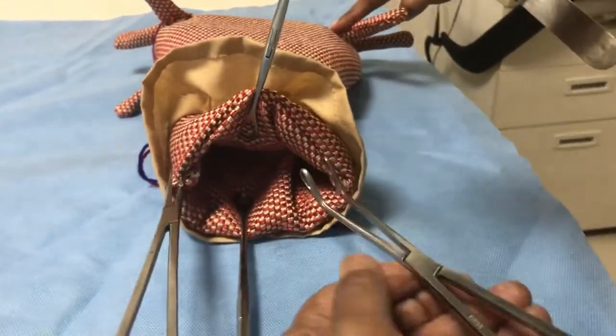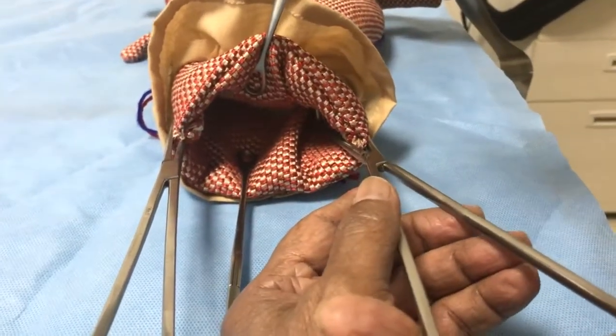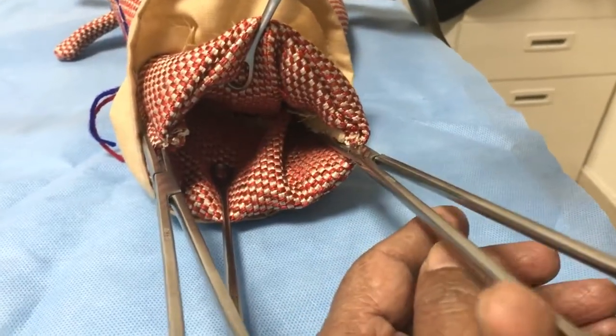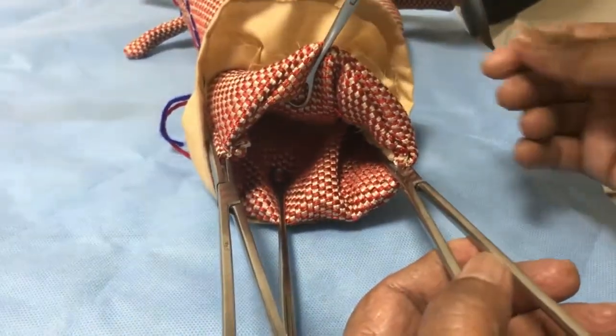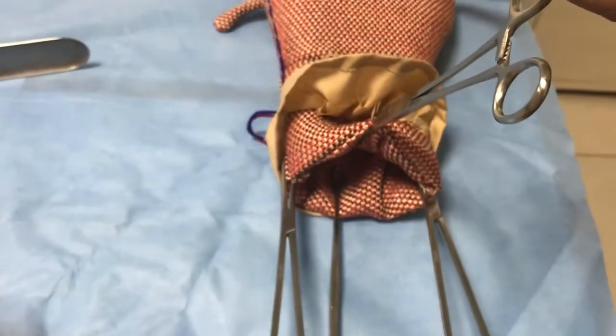Repeat the same thing on the opposite side — one blade inside, the other laterally — go up and then again deliberately push up a little more and catch it. This way, both uterine arteries are occluded and blood supply to the uterus will be cut off.